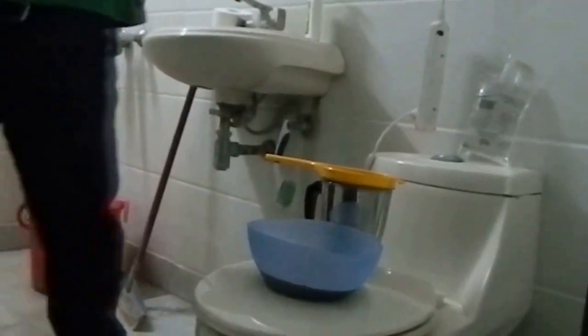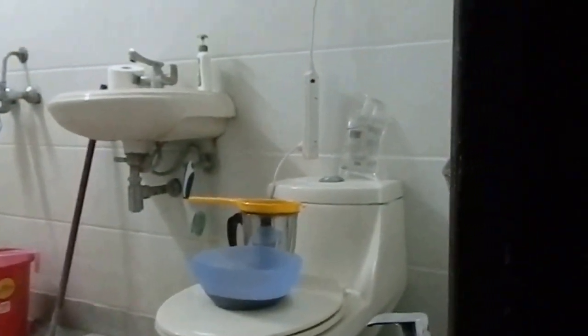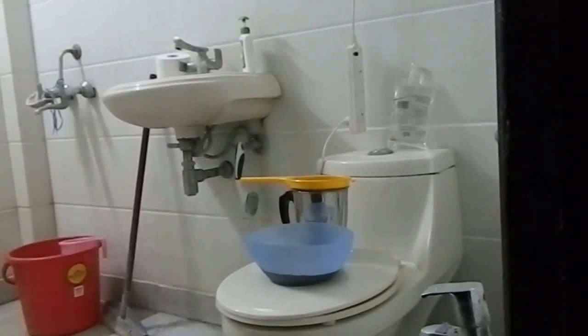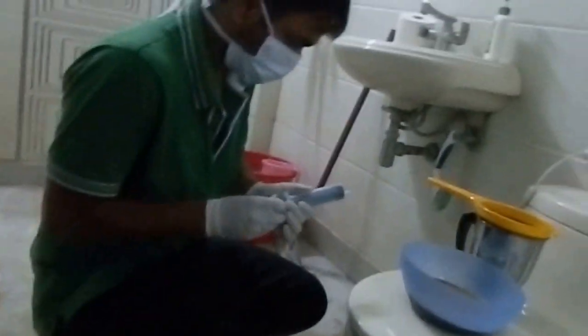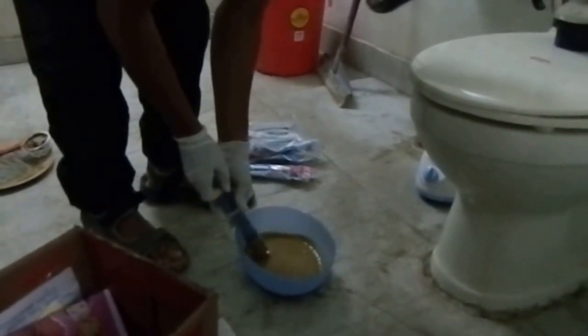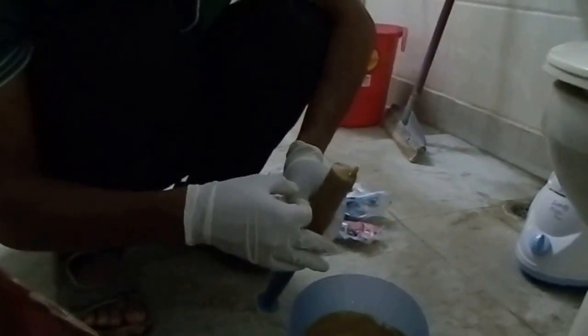Now we are through with the most difficult parts. You only have to put it in the syringes. We have seven syringes and all of them have to have approximately 50 ml of poop. If you have done this right and the consistency is alright, this should have no problem coming up the syringe — you see, this comes up easily. You have to make sure that we get 50 ml in each one, and right now tissue paper is a lifesaver.